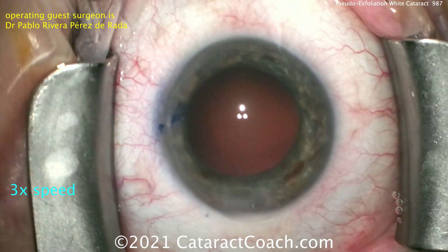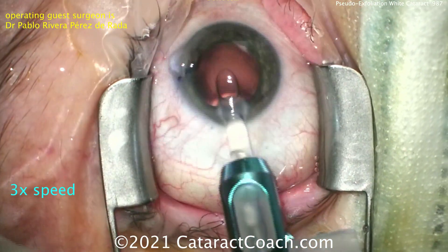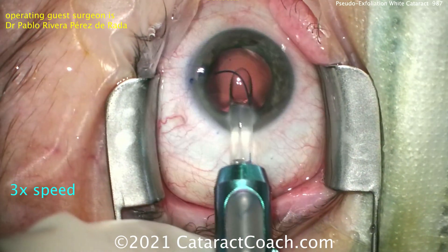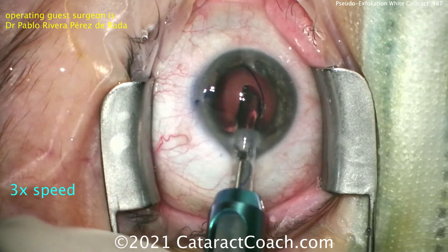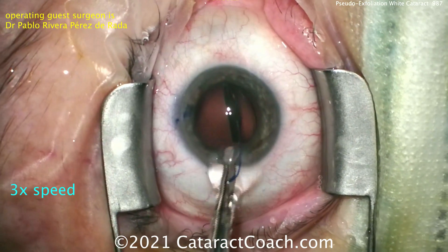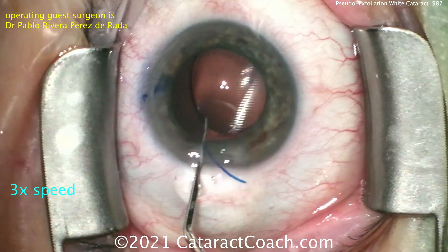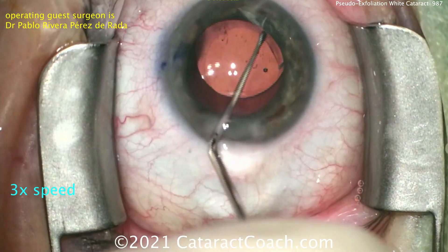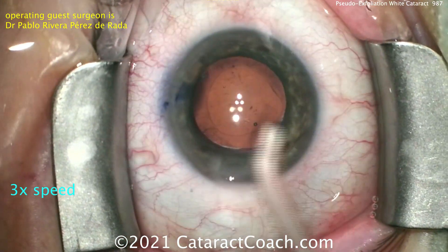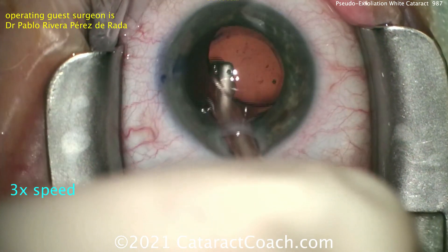And now here comes the lens. Zooming out a little bit — looks like a three-piece lens, getting that tip inside the eye. First haptic coming out — remember our 7L rule. There's the first haptic like the number 7, beautiful optic coming out. And that trailing haptic is going to be in the orientation of the uppercase L. There it is — it goes in the eye quite nicely. You can see that capsulorhexis is a good size and it overlaps the optic. The one area where it went out a little bit is of no consequence.